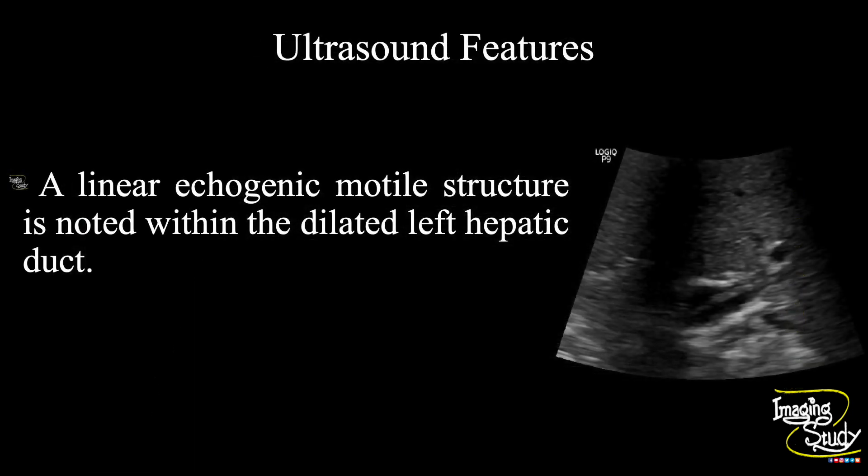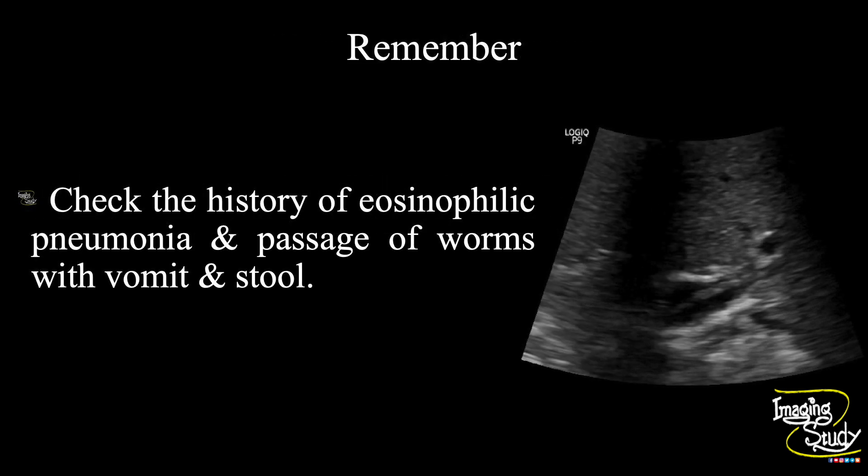In summary, a linear echogenic motile structure is noted within the dilated left hepatic duct indicating biliary ascaris. Take-home message: check the history of pneumonia and passage of worms with vomit and stool. As we know from the life cycle of Ascaris lumbricoides, this patient will have eosinophilic pneumonia, and then the patient will come to you with gastrointestinal complaints.